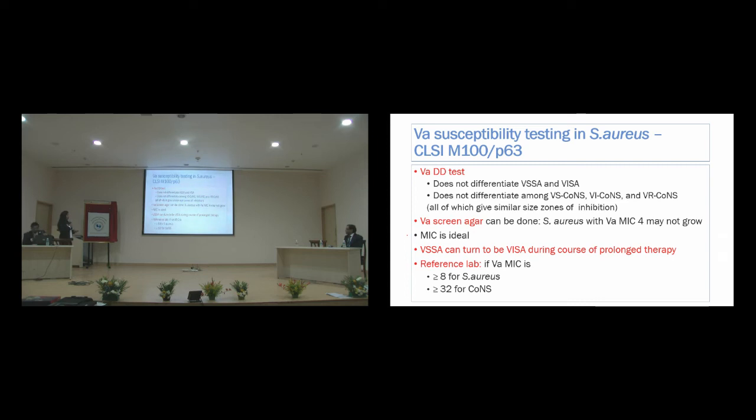So any value, if vancomycin MIC is more than 8 for Staph aureus or more than or equal to 32 for CoNS, has to be sent to the reference laboratory.